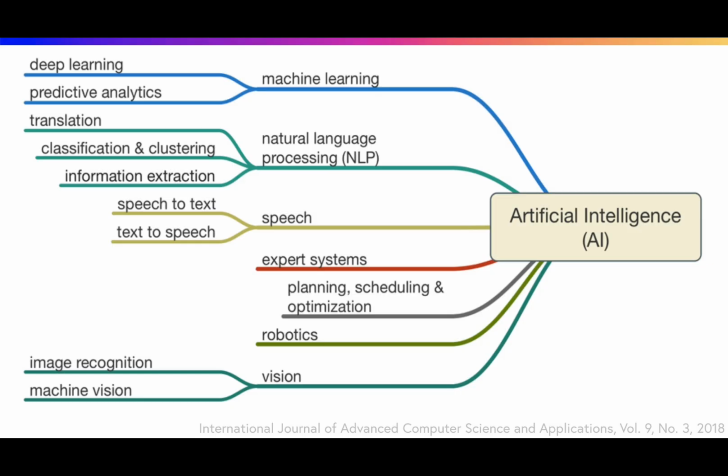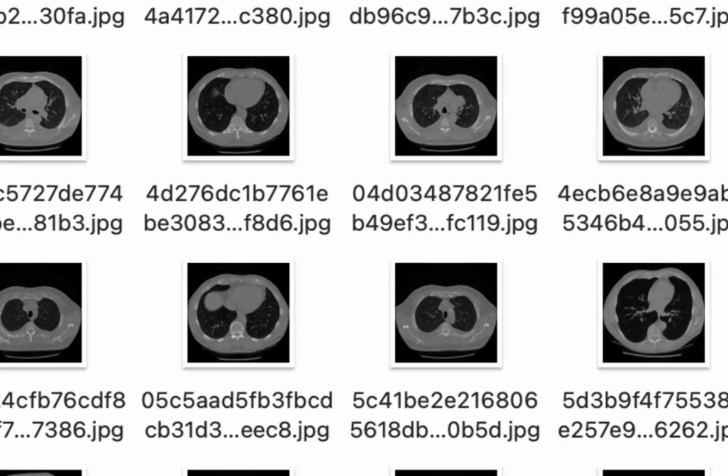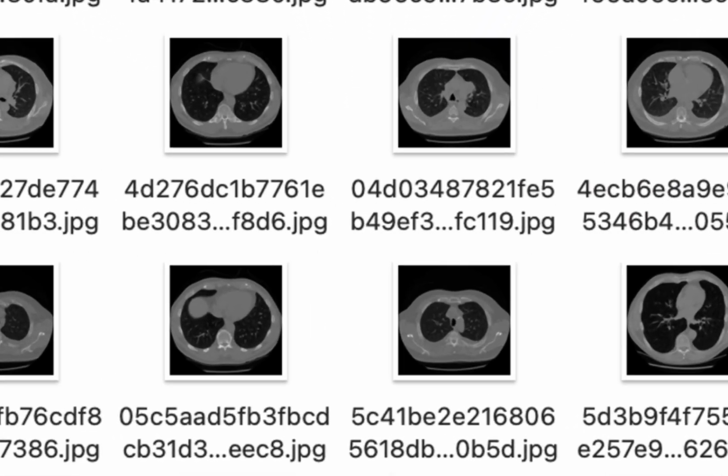A convolutional neural network, or CNN, is a special type of branch of machine learning which is highly effective for image analysis and is particularly better at processing high resolution images quickly. CNN models are very accurate, but the accuracy of a CNN model depends on the amount of data that we, the user, give it so that the model can train on.